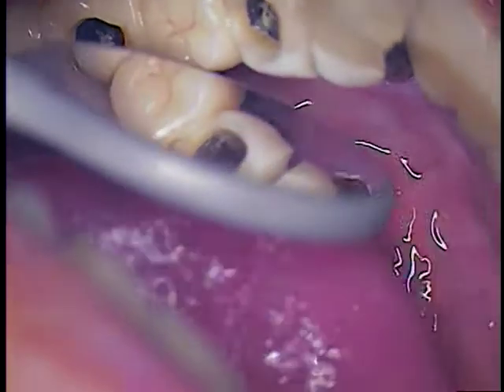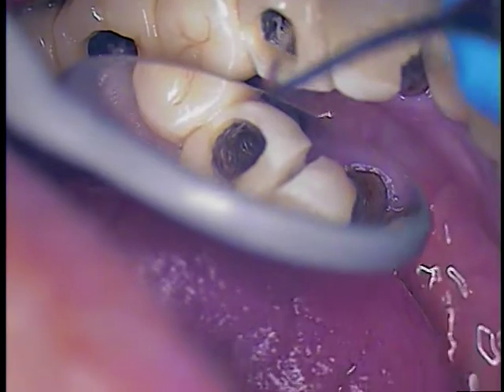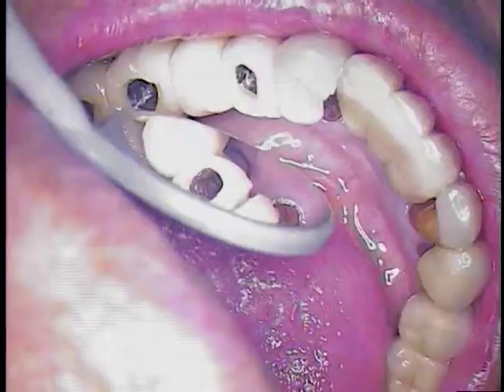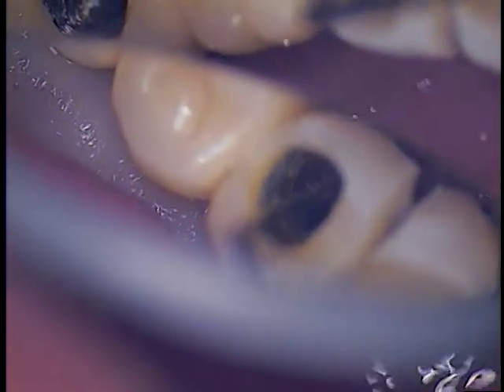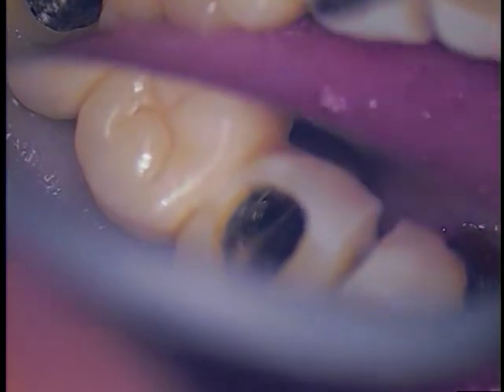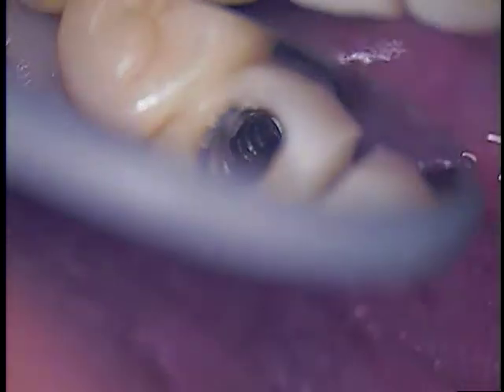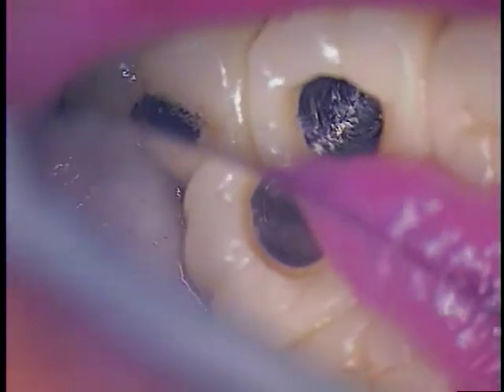Here's what we found. We gained access. Here's the Zimmer. If you look all the way down in the Zimmer access, you'll see almost a 40-degree screw. That's all the way down in there. Here's a better shot — see if you can see through my mirror. Here's the screw; you can see the movement on that. There's the screw — that's the one on the Zimmer. Now here's the Brandenmark I'm drying.